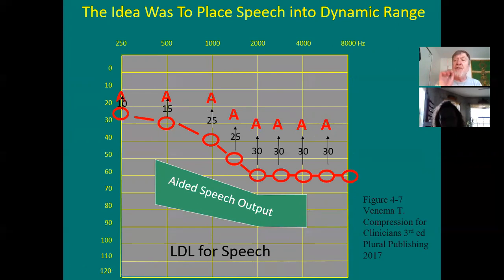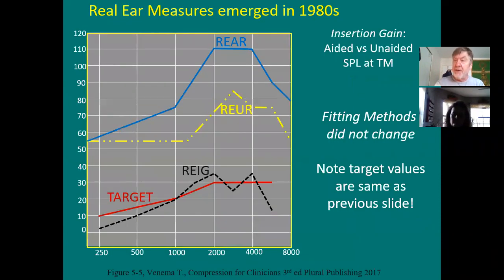Regardless, the philosophies of the fitting methods were all the same, namely, so that output speech would sit nicely in the dynamic range of the listener. They couldn't see this, they just hoped that it would happen. H-O-P-E. That's what they had, the faith, F-A-I-T-H. And the love.